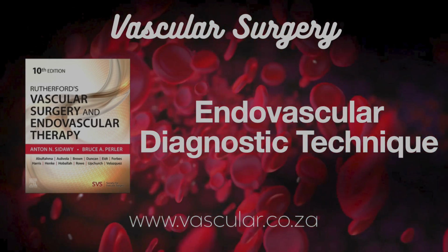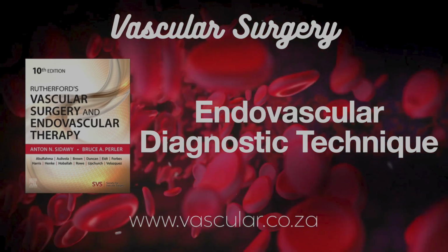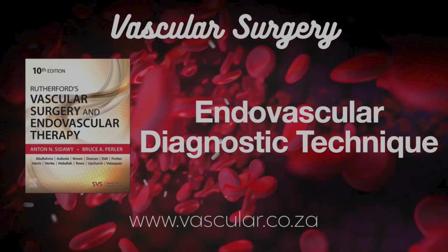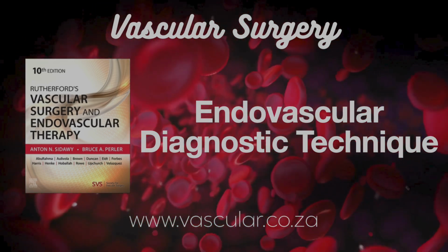Not really. Pedal access going from the foot has largely replaced it. Compression behind the knee is really difficult, lots of fatty tissue, makes hemostasis unreliable. And you need imaging. Absolutely. Ultrasound is essential if you ever consider it, just to even tell the artery from the veins.